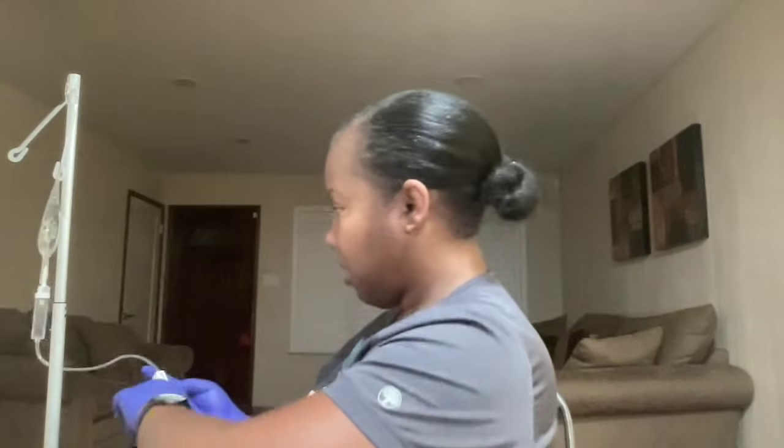Okay, and if you recall, the rate for the IV fluid is 38 drops per minute. So it's important that we time this, and then we will count the drops. I'm going to use the roller clamp to regulate the flow.